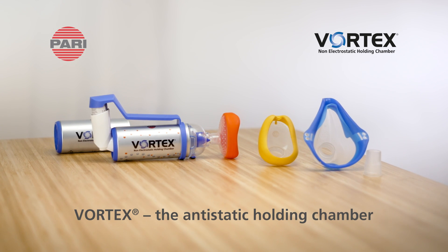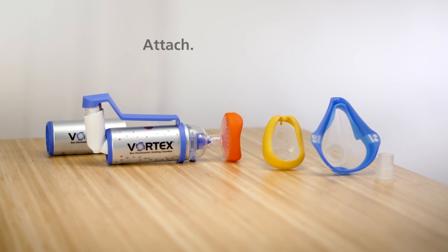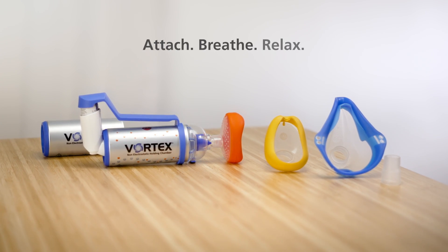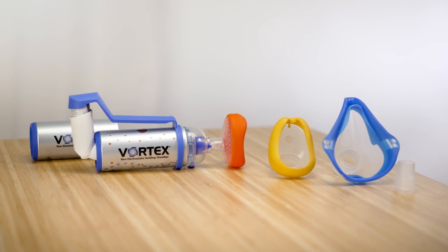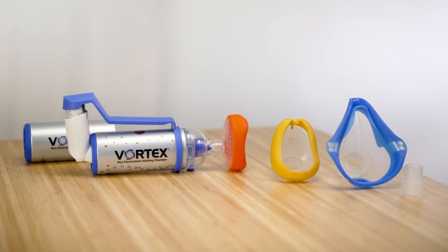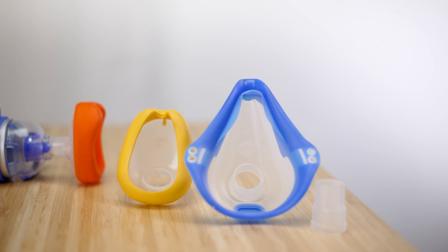Vortex, the anti-static holding chamber, so that the active substance reaches where it's needed. To make sure that it's used safely, we recommend that you clean the Vortex and accessories after each use and disinfect them at least once per week.